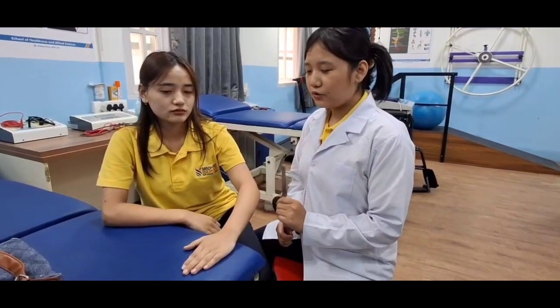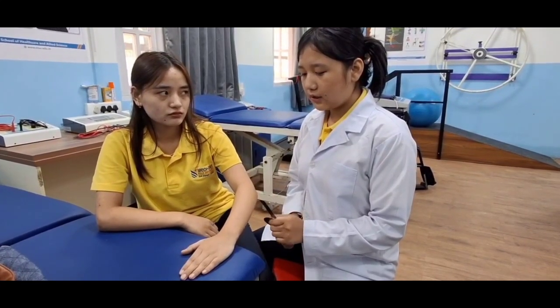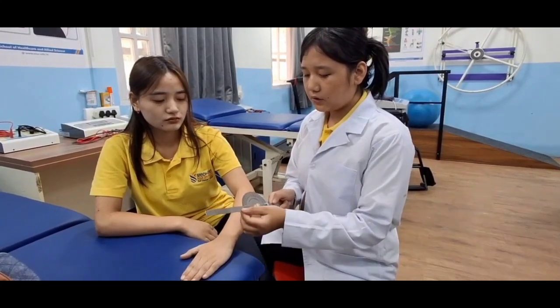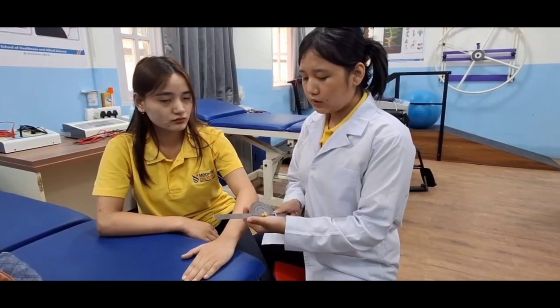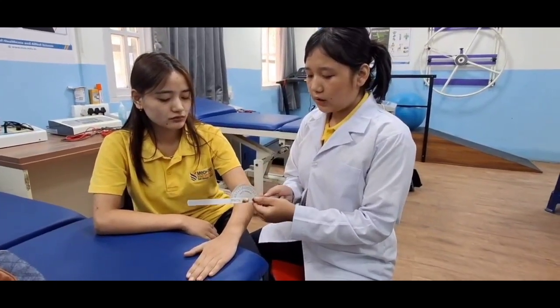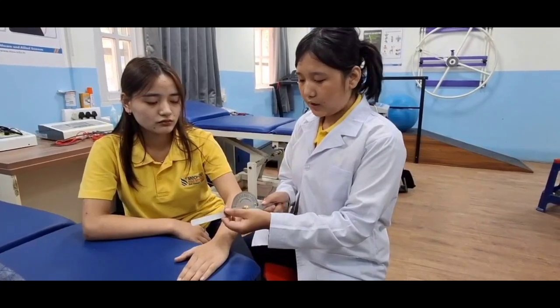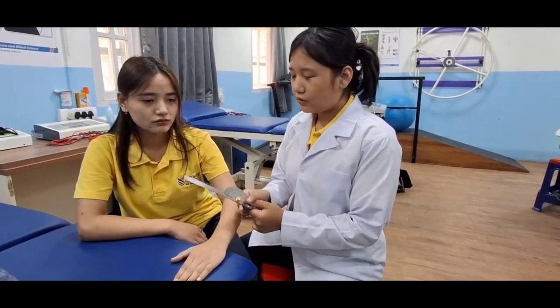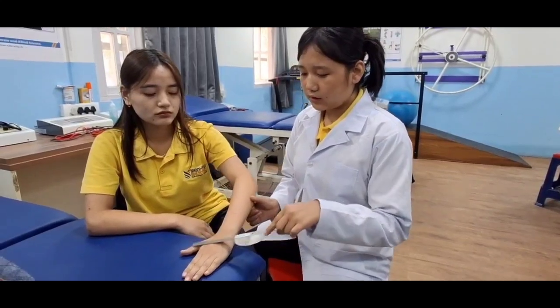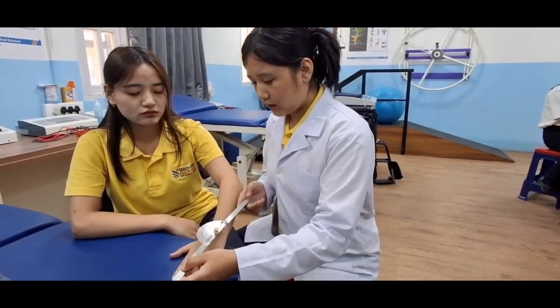Hello, I'm going to demonstrate goniometry. This is a goniometer, and what it does is measure the range of motion. I'm going to talk about the parts of this goniometer: this is the fulcrum, this is the body, this is the moving arm, and this is the stationary arm. I'm going to take the range of motion of radial and ulnar. This is radial and this is ulnar. Let's check her range of motion.